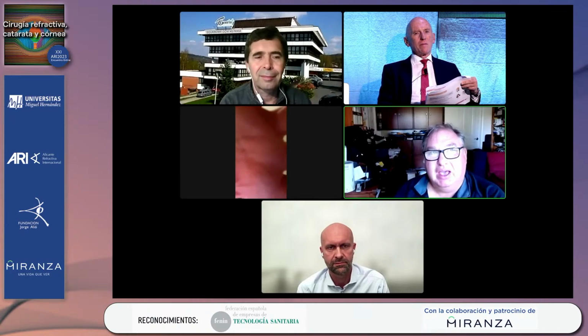We've shown the centration in trifocals. What we have seen, looking at the visual acuities, especially uncorrected distance visual acuity, is that we do see an improvement there. We haven't reported that here because we want to do a multi-center study to really prove that out. But if that is true, intuitively, when you have a centered capsulotomy, you get no tilt and it's centered on the optic, you minimize dysphotopsia, and you give the most stable foundational support for the IOL. I think that is the potential new future in the near term in our research. So that's where we're focused right now.